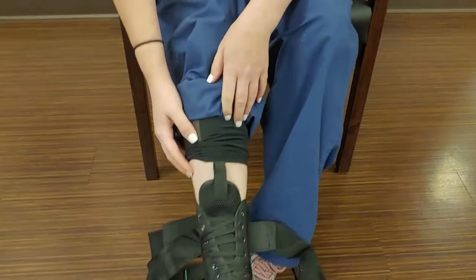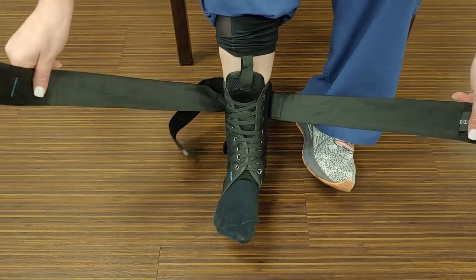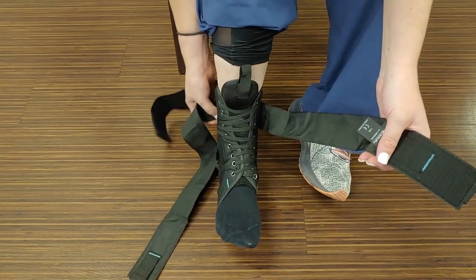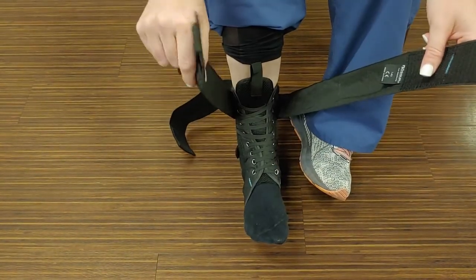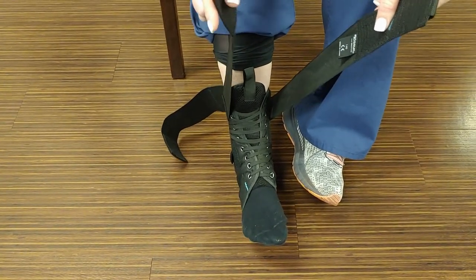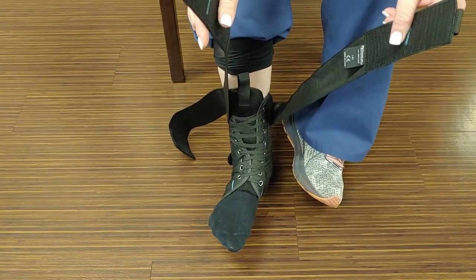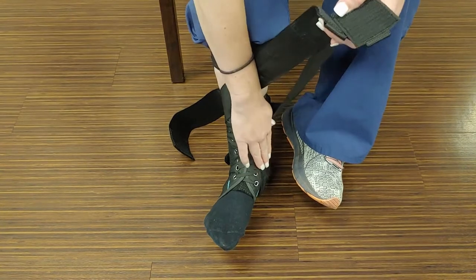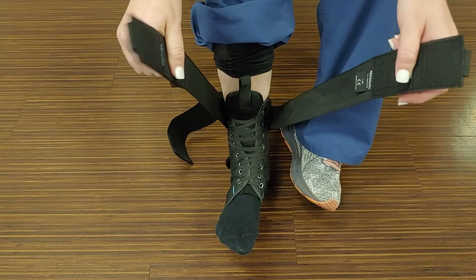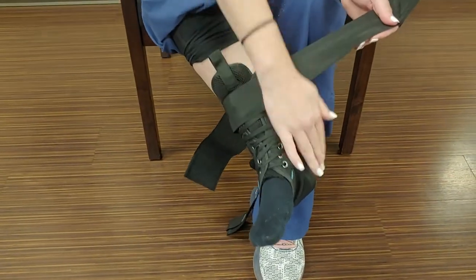The next thing are these two straps, which can be really confusing, but it really depends on what you're needing them for. If you are having some ankle instability — like you just had an ankle sprain — you're going to want to swing your ankle over like that, and that's what these straps do. But if your issue is a medial ankle sprain, or the inside of the ankle, you'll want to swing it the other direction. So let me show you how you can manipulate that.